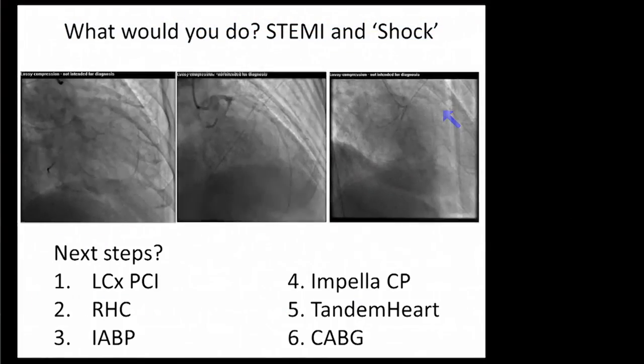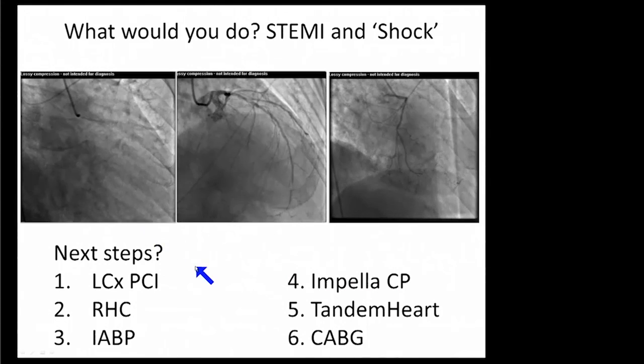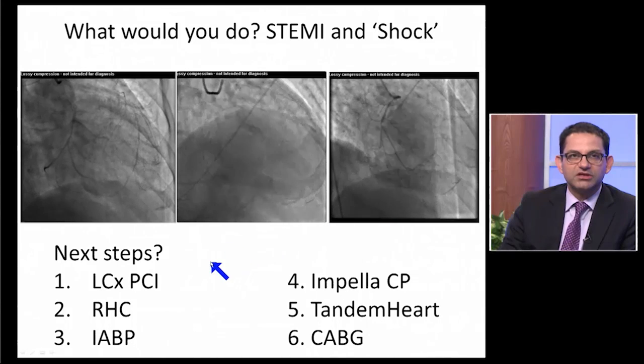Yeah, I think it's a really important point. As we go by our NCDR metrics and we look at when we can check the box of cardiogenic shock, right now you can't really check the box. The blood pressure is over 90. You do have a narrow pulse pressure, 110/80. And your exam and your clinical intuition is telling you that this probably is cardiogenic shock, but you still have to document it. So that's where we then took this patient to the cath lab, and we then performed a coronary angiogram, which I think is a very important primary step in evaluating these AMI shock patients.